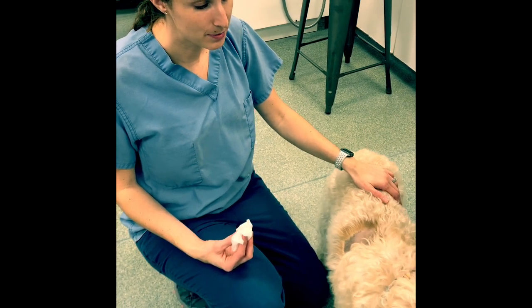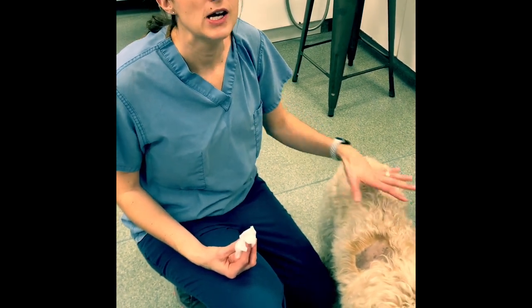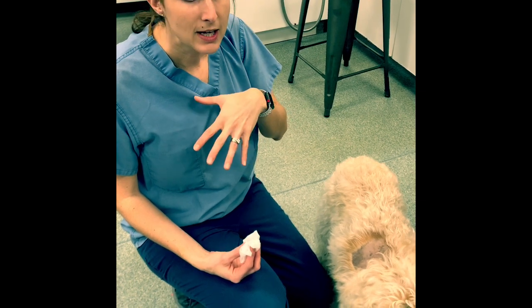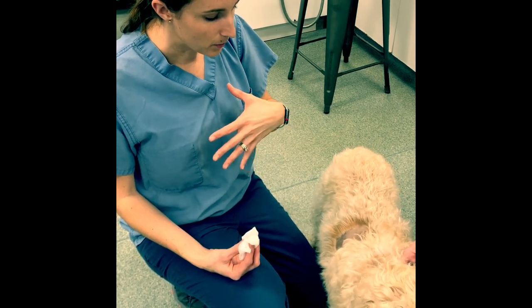We are going to put on a super cool monitor for our boy Mick. Mick is a diabetic and we've been having a little bit of difficulty getting his insulin and blood glucose readings to be where we want them to be. It's difficult to do in-house glucose curves and make sure that we have all the parameters the way we want them.